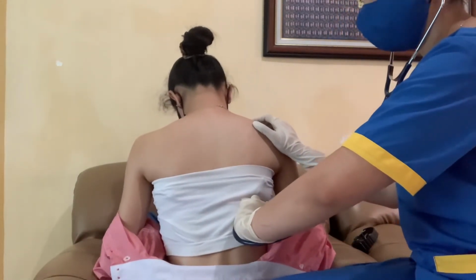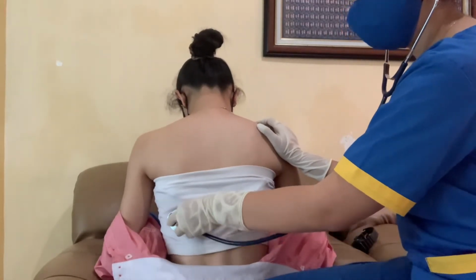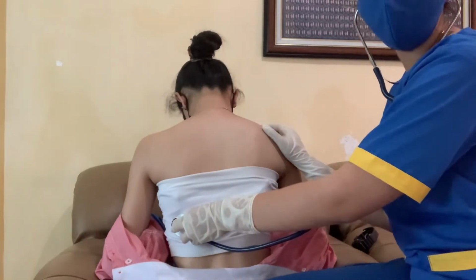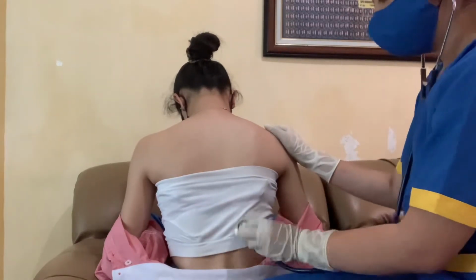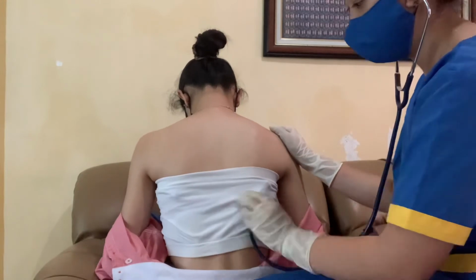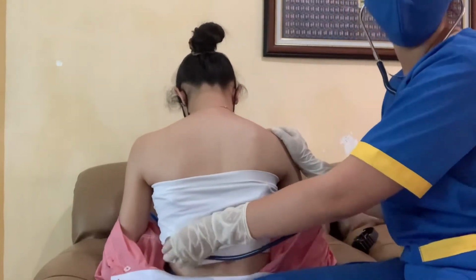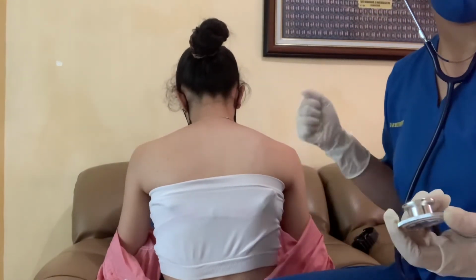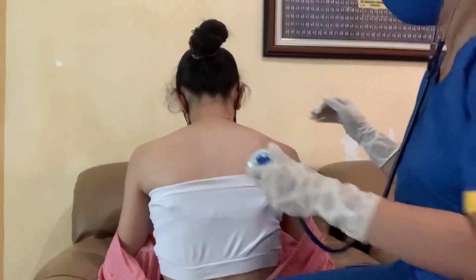Inhale, exhale. And the midaxillary line. Inhale, exhale. So now we will proceed again with the bell and start again from the apex to the midaxillary line.